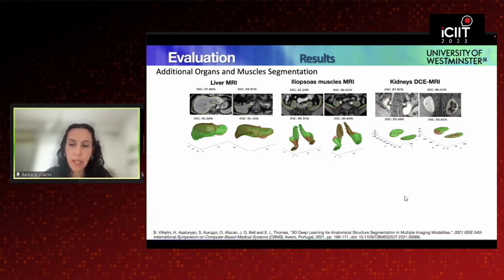structure with high variability, and the kidneys dataset contains quite challenging data because it comes from a pediatric DCE MRI dataset with clinical normal and abnormal kidneys with varying levels of hydronephrosis, which is a condition where kidneys show irregular size, shape, and location. And the segmentation results continue to demonstrate, anyway, statistical stability despite a high variability.